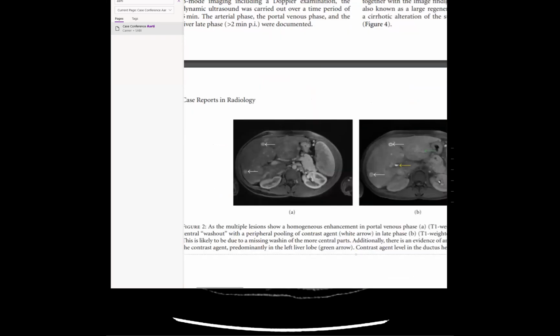That's interesting because you can see that in FNHs too, because the central scar, since it's a scar, doesn't have the OATP receptors. So these also have a central scar? I don't know about that central scar here, but the case report described this central washout, and then you have EOVIST uptake into the periphery, which is seen in FNH-like lesions. That was cool. I didn't know that. Yeah, since they're FNH-like, maybe it is the central scar thing. FNH is a proliferation of hepatocytes in reaction to a vascular abnormality, and that vascular abnormality is usually in the center, like in the scar. Oh, gotcha.